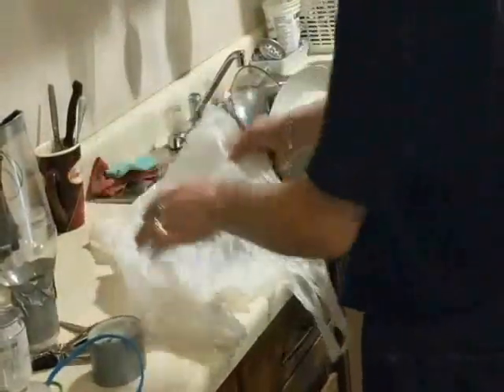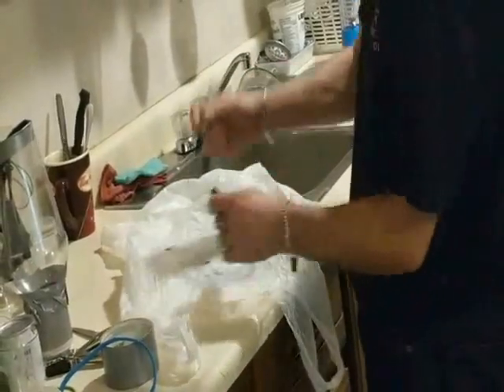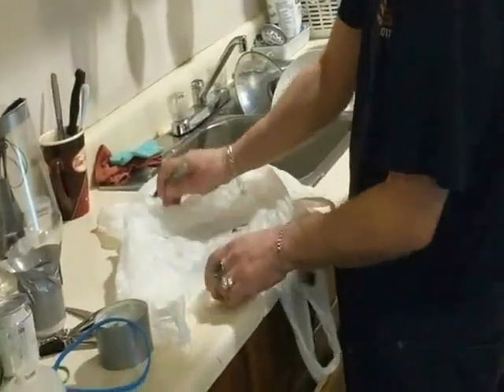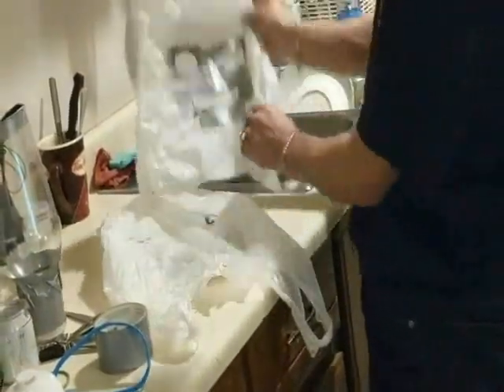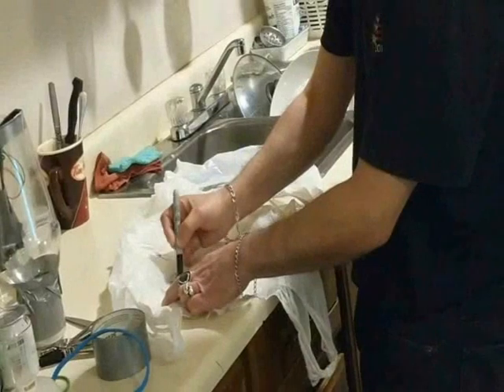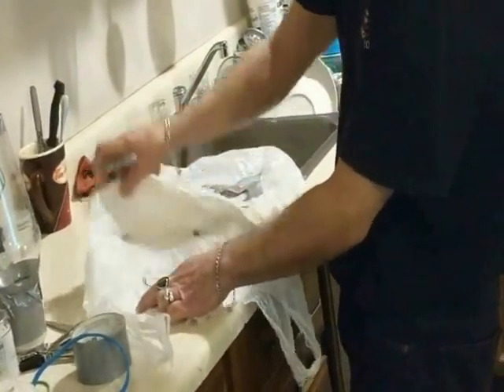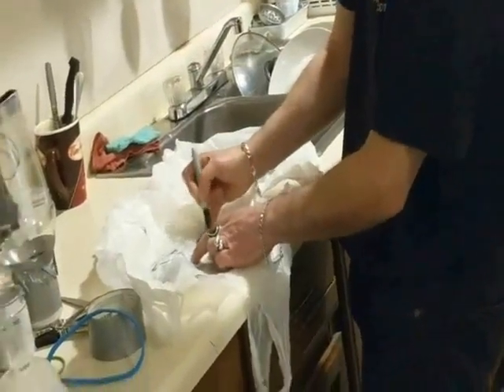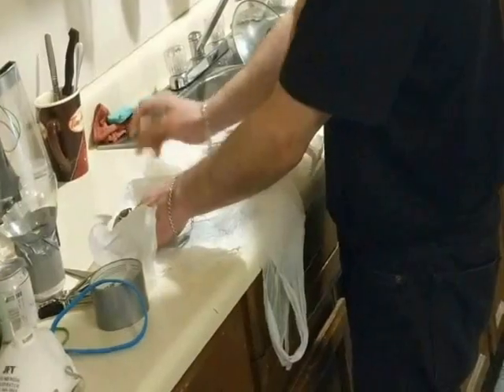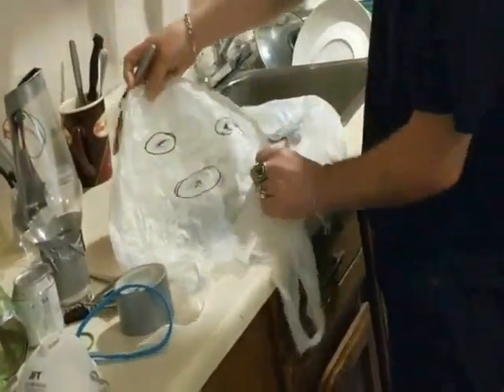And like what I was saying, okay, since you know where your eyes are now and your mouth is now, so let's just say we want to make the area where your mouth is like this a lot larger. So let's just go and make your mouth larger. Remember that you want it to be even with the bag. Your eyes are going to be over here, so this is where your eyes are going to be. Give it a good outline so you can see. You don't want to have a little hole, right?